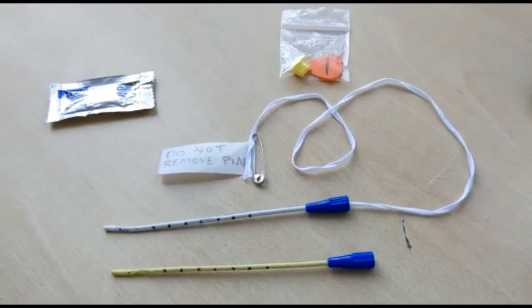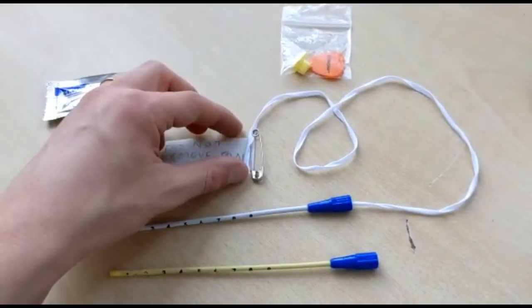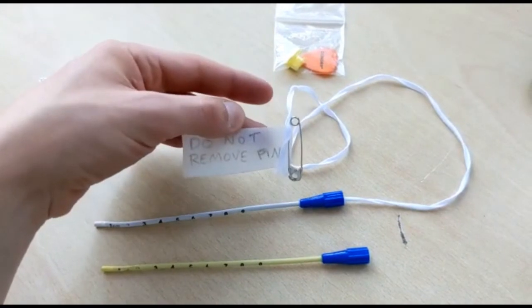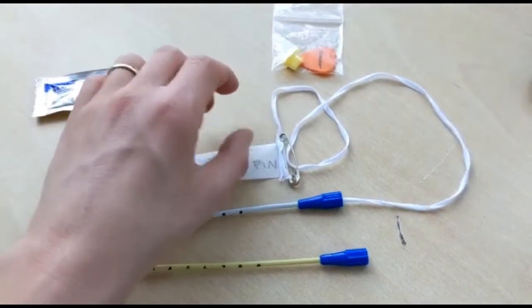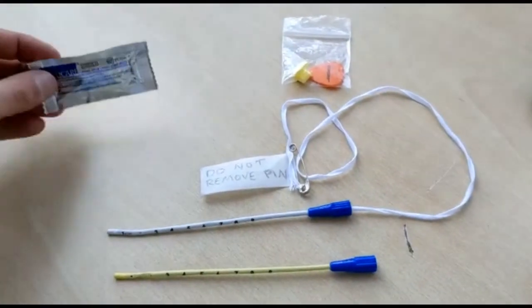In the test kit there is a safety pin on the end of the white string. This is only to make the test kit reusable. Lubricant is supplied in the pack. It is usually required but not with a test kit.